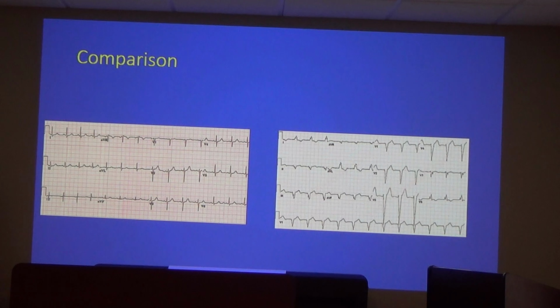I got the other diagram. You have mirror images, like in lead 2, almost, right? So that's inferior. Lead 2 is inferior, right? Yes. But 2, 3, and aVF are inferior. So what that's telling you with 2, 3, and aVF being negative is that a lot of the direction of the vector is upwards, which makes sense if it's come down the right ventricle and then it has to go back up to the left ventricle, up and over and leftward, to some degree.